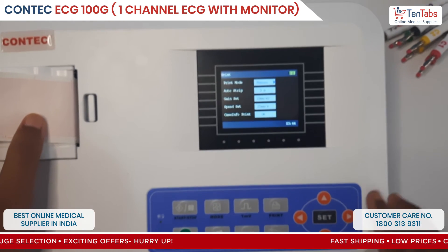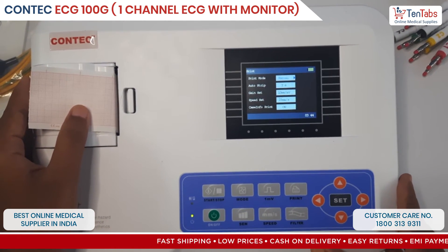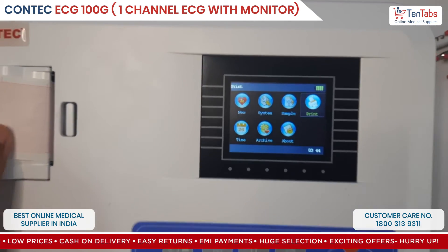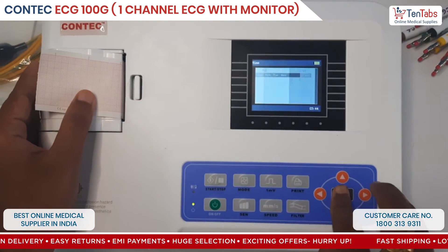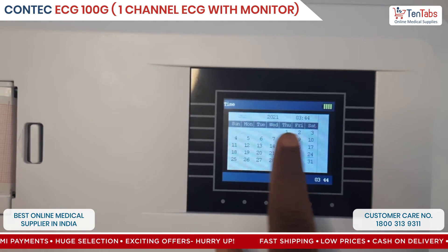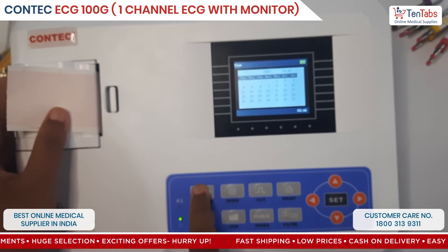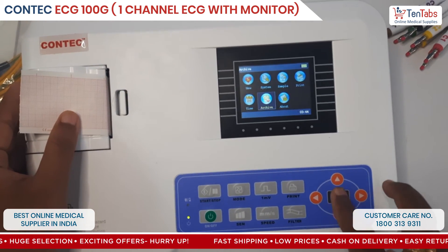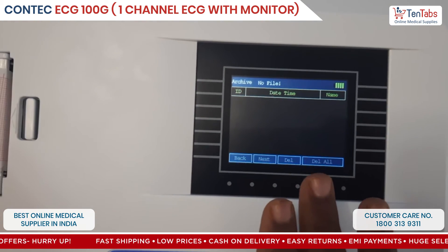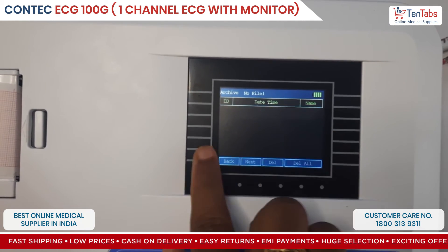The printing speed and mode can be set here as well, along with the month, date, year, and time. All of these details can be configured in the settings. And here, if there are any ECGs already taken, you can find those records here.